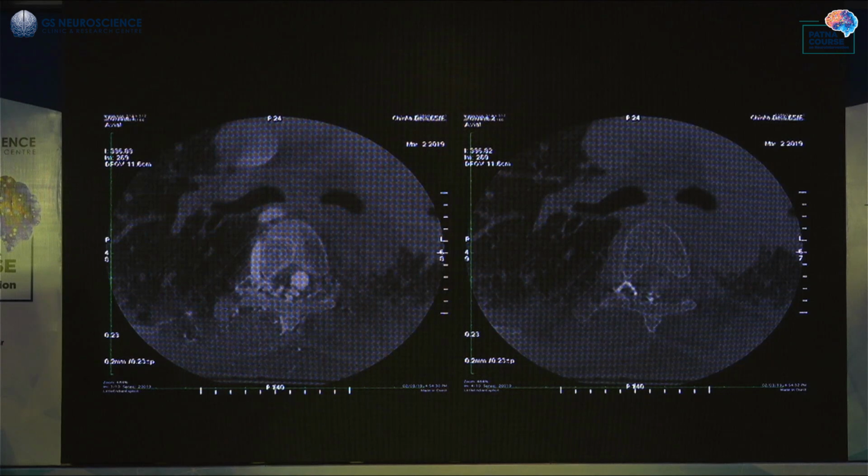What is again important to see, these are cone beam CT images of the dural fistula before embolization. You have the posterior radiculomeningeal artery, which is forming the fistula on the dorsal surface of the dural covering. And then subsequently, this is the connecting link. This is the extradural to intradural venous connection, and that is the venous pouch. This is the pedicle which is supplying the dural fistula.